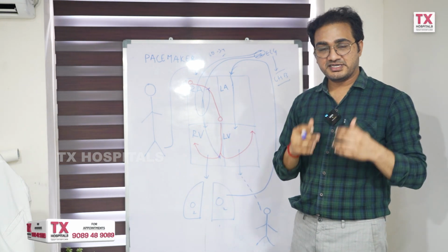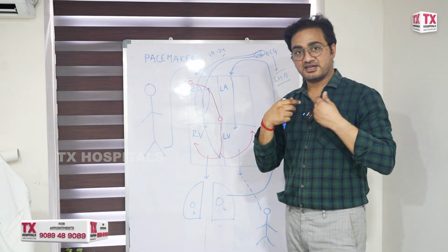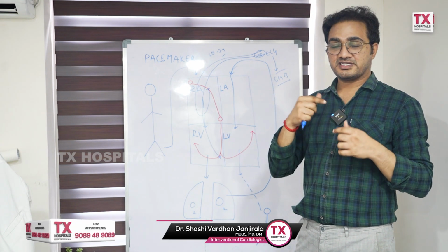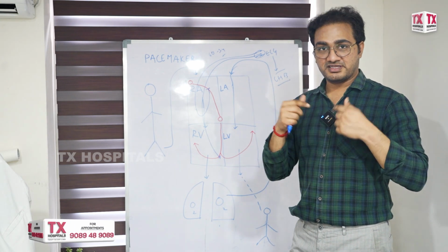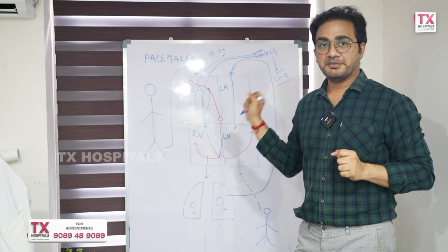So why do we need a pacemaker? We need a pacemaker when the inherent internal electrical impulses of the heart tend to slow down. The patient cannot function as he was functioning prior to that. So for all the chambers to contract simultaneously, we need a pacemaker.